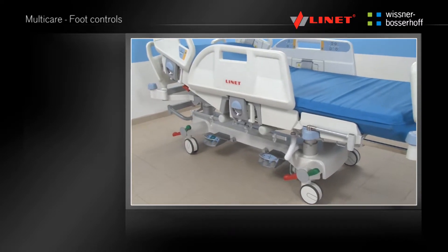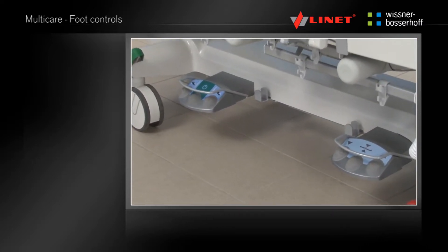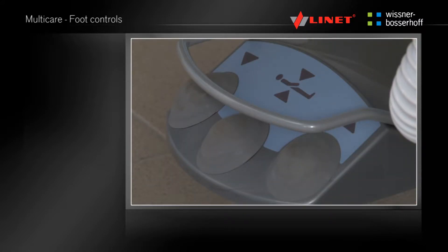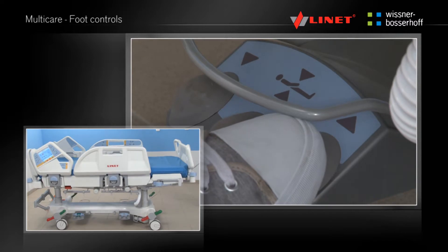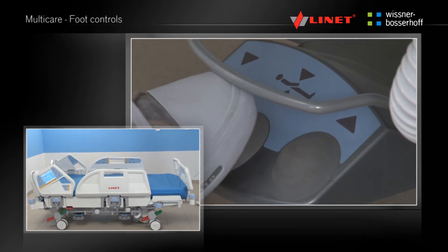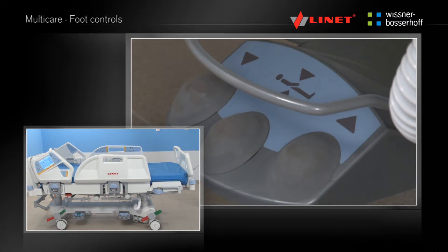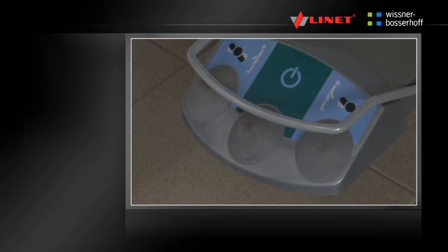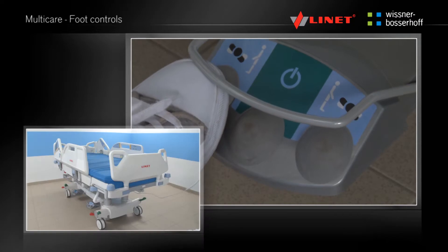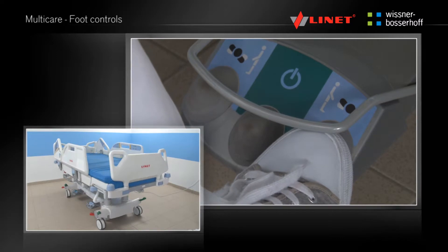The MultiCare is equipped with two pairs of foot controls. Lift the protective bar covering the foot controls before positioning — this can be done using the foot. The Go button does not need to be activated for the foot controls that provide the user with the height adjustment and examination position buttons. The Activation Go button must be pressed in order to use the foot controls for lateral tilt up to 15 degrees.